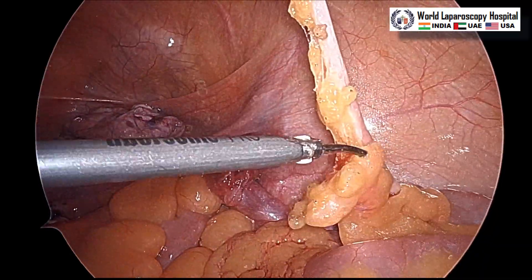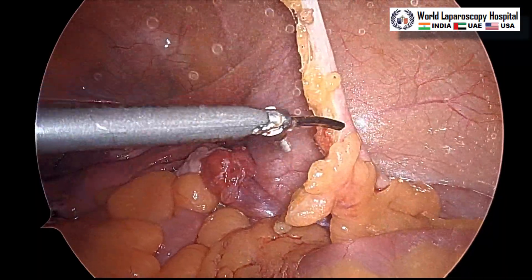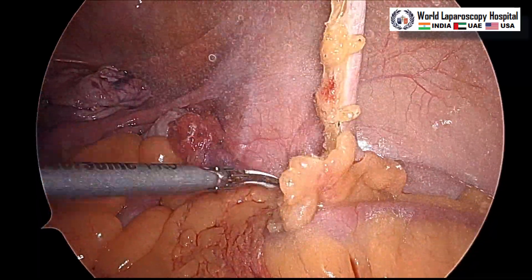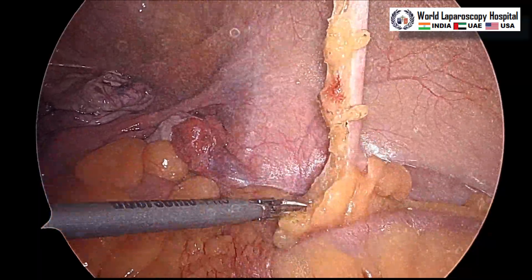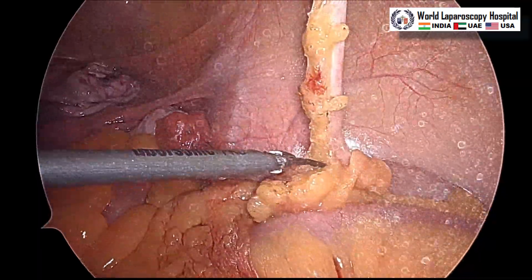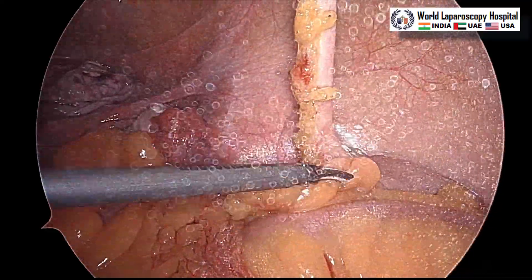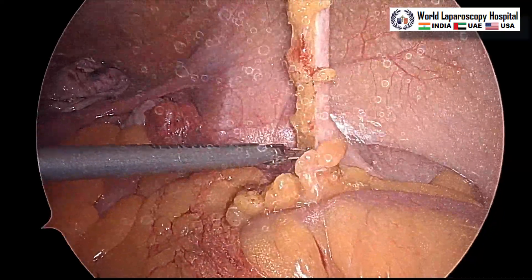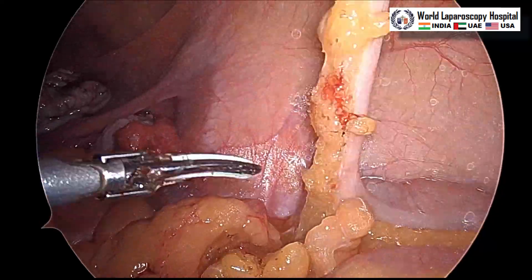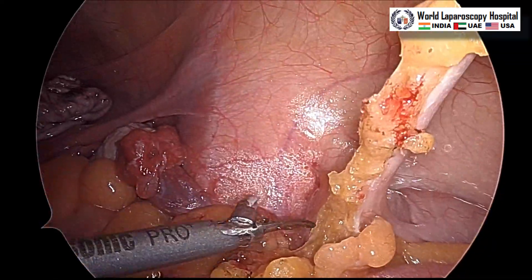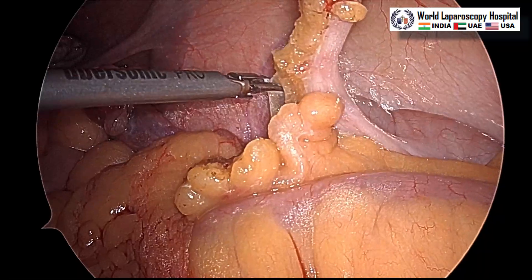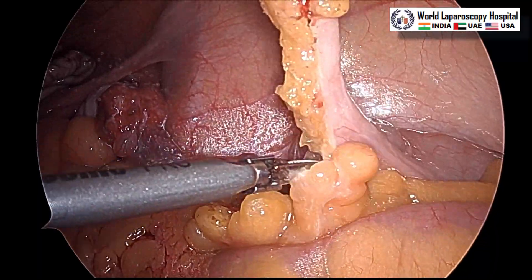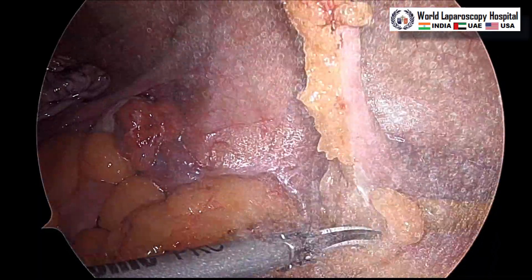Harmonic, bipolar, LigaSure — any instrument can be used for the mesoappendix. Slowly it has to be separated. You should be careful that the tip of the harmonic does not accidentally touch any bowel or cecum to prevent a thermal injury and puncture. We can see it is reaching up to the base and the taenia coli is now visible. If there is lateral adhesion with the paracolic gutter, just try to separate it. We should go completely up to the base to prevent any incomplete appendectomy.